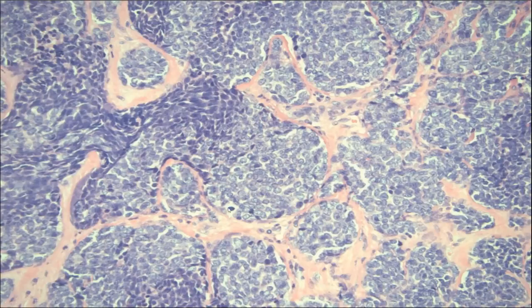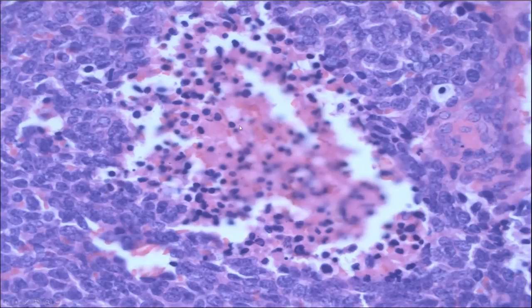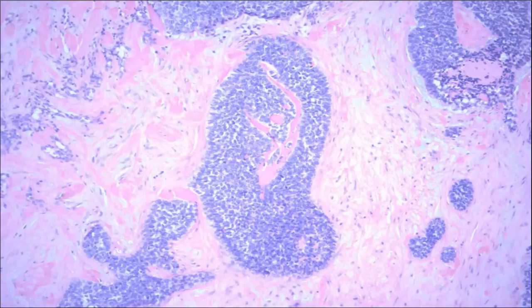And again, very undifferentiated, mitotically active, little cytoplasm, some necrosis, so we have no problem saying whether it's malignant or not. In one peculiar area, though, we had nests of these basaloid type cells with peripheral palisading at the edges and this basement membrane type material in the middle.